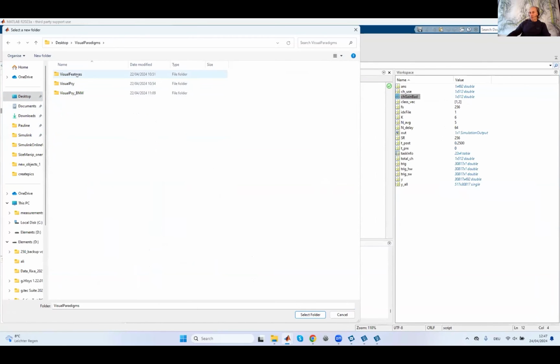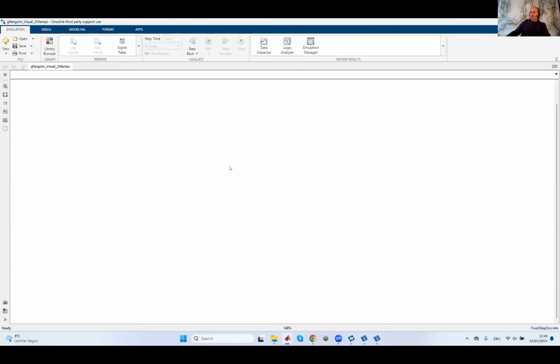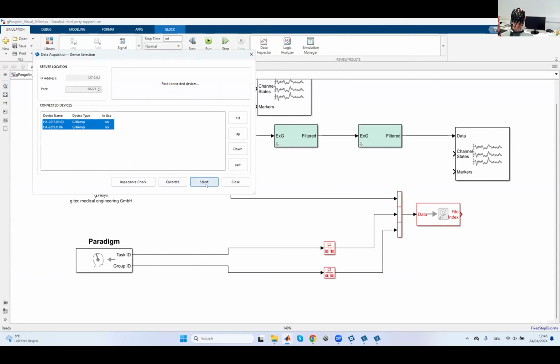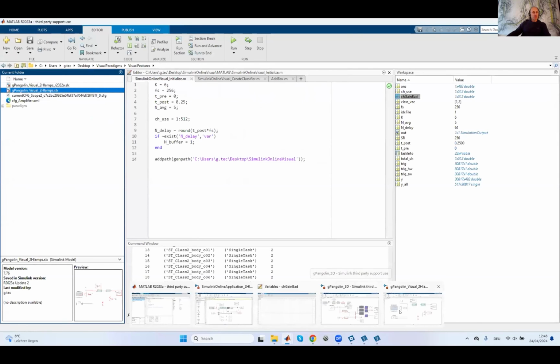Sarah is asking, what's the highest number of EEG electrodes you ever measured with the pangolin system? We had that already before. The first three questions are already answered. So I just ask for safety again.